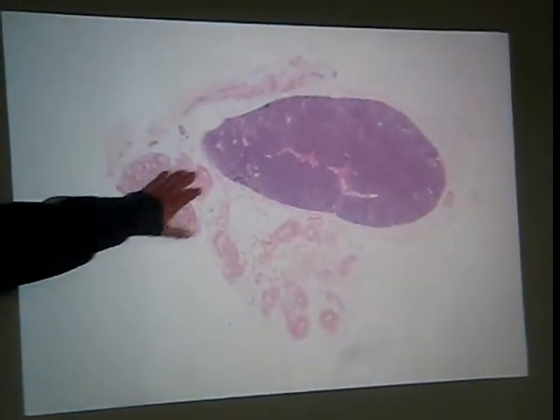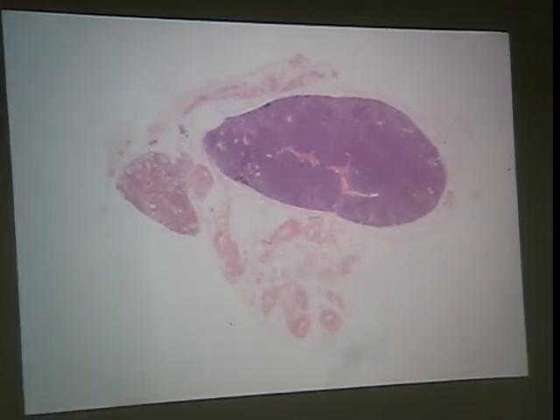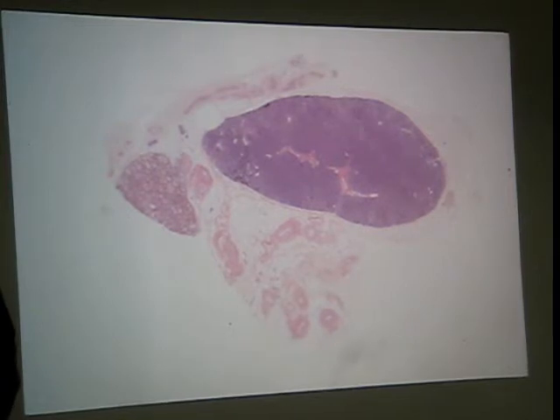Thyroid, right? Which context-wise would make that the, yeah. And what are you going to want to look for at higher power to validate that observation? What is a discriminating characteristic of the parathyroid? Well, first thing, is it an exocrine or endocrine gland? So you're not going to see ducts. All right, then what do you want to look for?